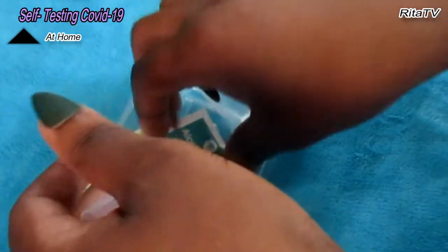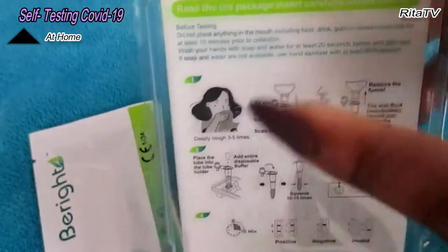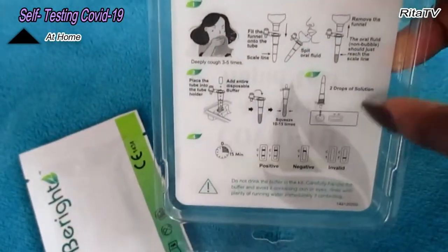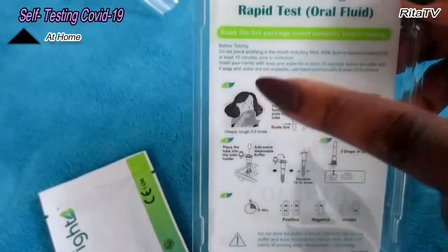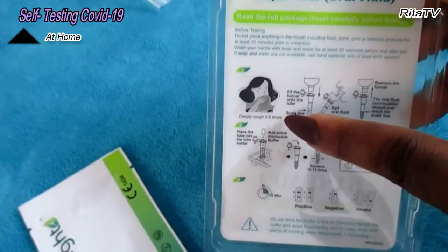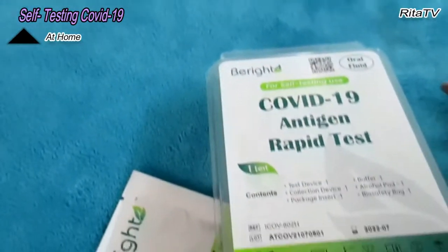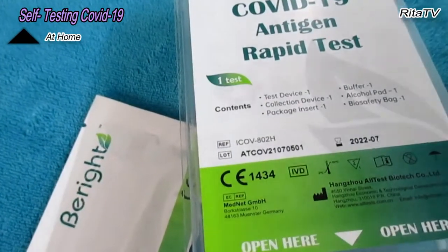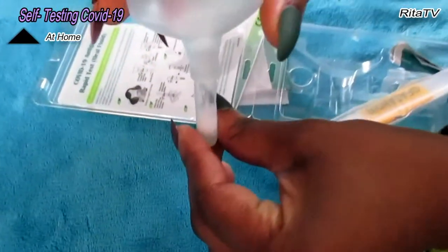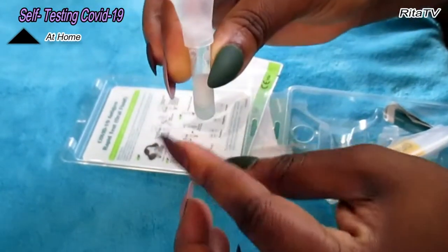Before then, let's read the instructions. As you guys can see, these are all the instructions that we are going to follow accordingly. The first thing first, we have to cough 3 to 5 times. Here's the spit. I already spit into this funnel, through this funnel down to the buffer.